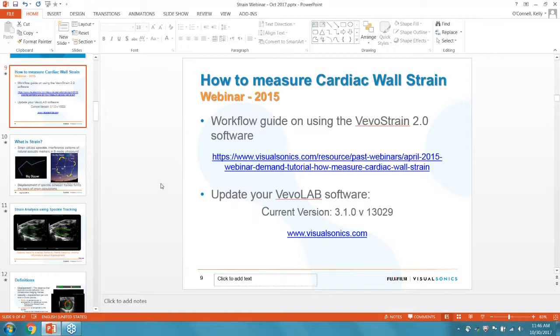So that webinar that I did back a number of years ago, I believe that might be with the older version of the Strain software, but the fundamentals are the same. That one actually goes through the point and click workflow to get your image into Strain, place the points, and do the analysis. So anybody that has questions about those sorts of things, go back and take a look at that webinar. It is quite informative.